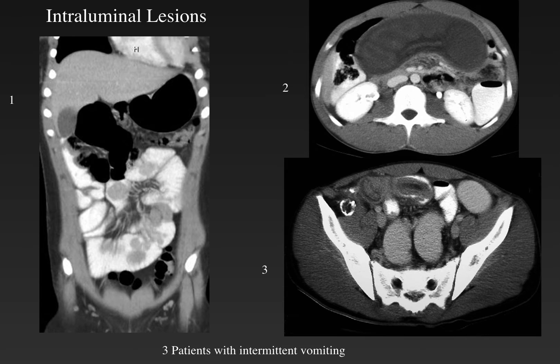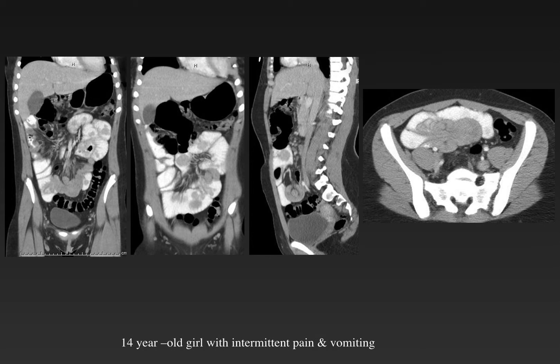Here are three patients with intermittent vomiting with intraluminal lesions causing obstruction. Pause the video and take a minute to look at each of these patients. The first patient is a 14-year-old girl with intermittent pain and vomiting, who has multiple filling defects throughout the small bowel and a small bowel intussusception. On physical exam, she had melanotic spots on her lips as the result of Peutz-Jeghers syndrome, with multiple hamartomatous polyps filling the small bowel and causing increasing small bowel obstruction as they grew.